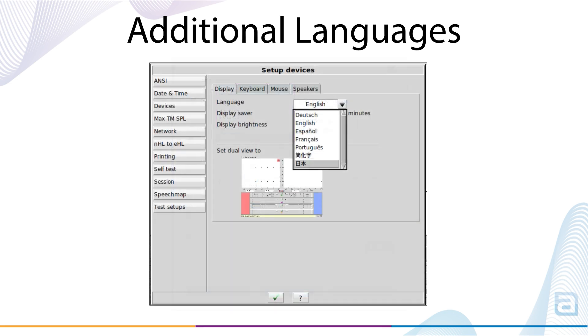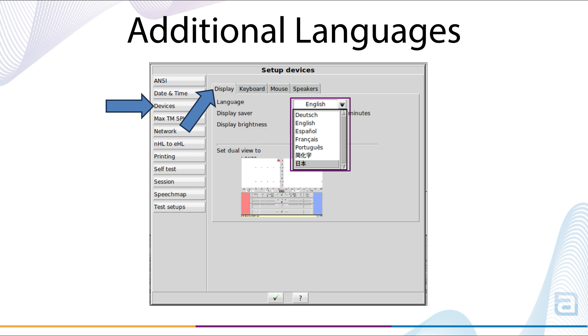On the Verifit 2 or Axiom, the language can be changed and set up by selecting Devices, Display, and choosing the desired language.